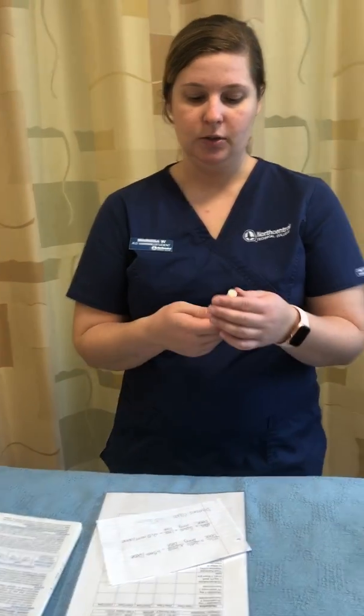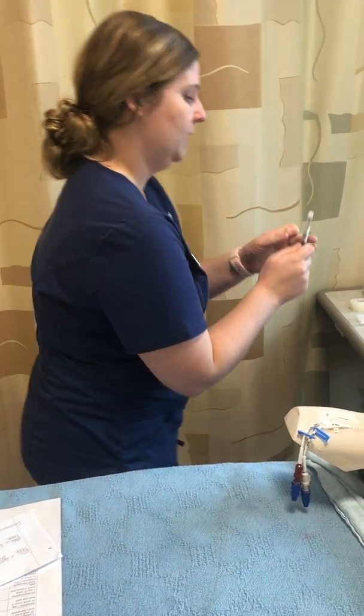If he had an IV hooked up, or any other medication or anything running, I would check and make sure everything was compatible to be given at that time, but he doesn't. He has a saline lock, so it's okay to give. So I'm going to go ahead and get dose accurate here. Again, I'm doing 1.5 mLs of this lorazepam.